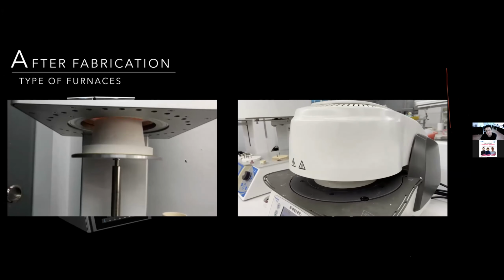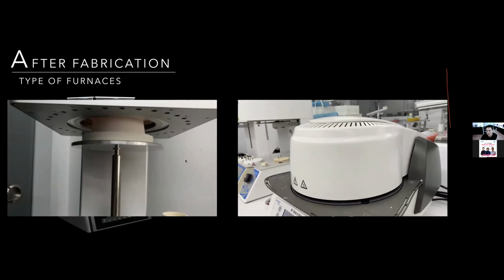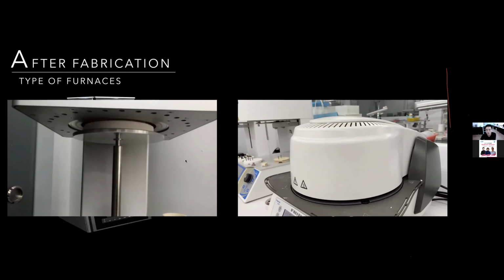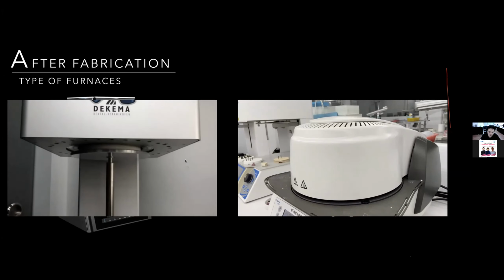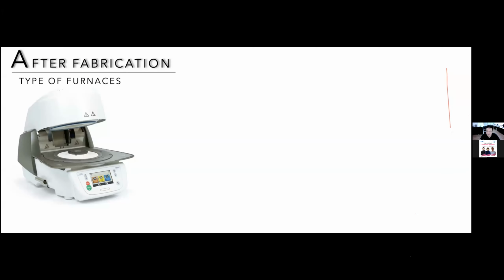So that means your heat source release is not very balanced. That will easily make your restoration not cool in a balanced way, and some areas will shrink too fast, and that will easily leave stress in your framework. So that is the danger.